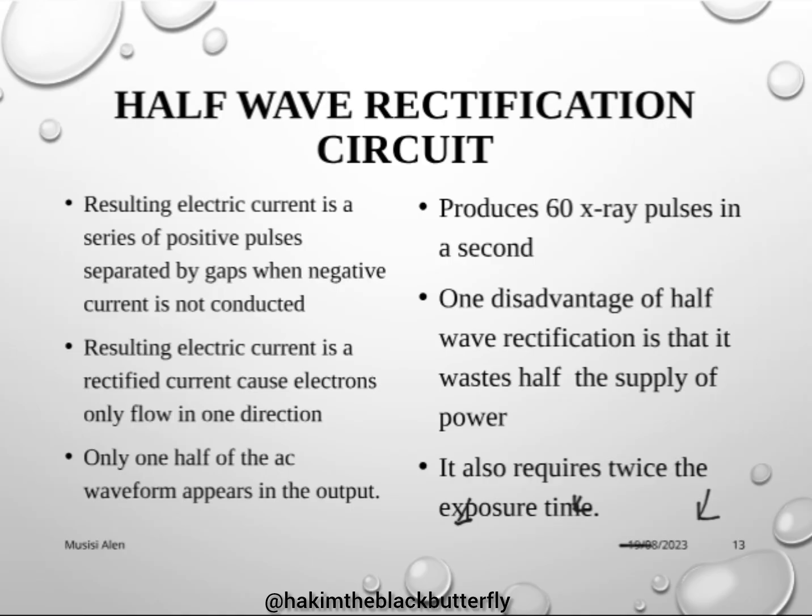One disadvantage of half-wave rectification is that it wastes half the supply of power. It wastes half the supply of power because the negative voltages have been removed. That power has been lost.